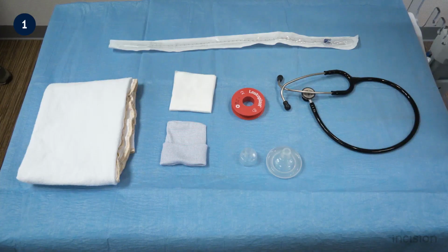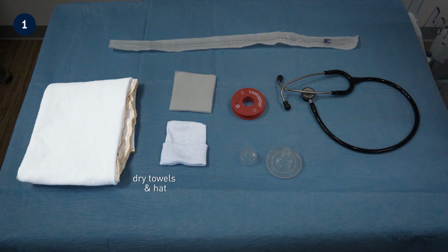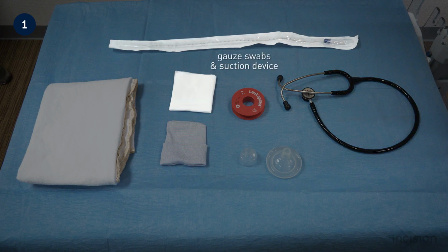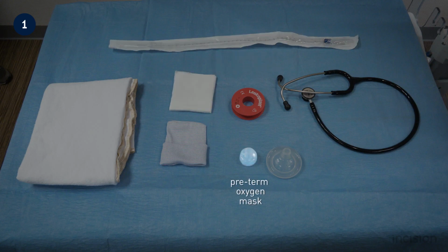The following materials and instruments are prepared: dry towels and a hat to dry the neonate and maintain temperature, a stethoscope to assess respiratory condition, gauze swabs and a suction device to clear the mouth and airway, and an oxygen mask for preterm and term infants.